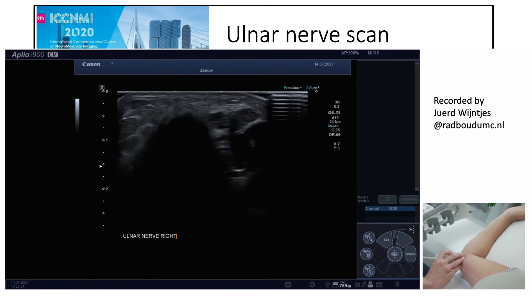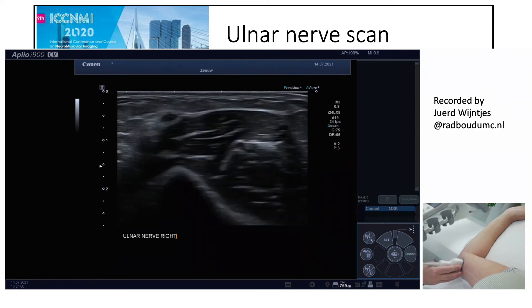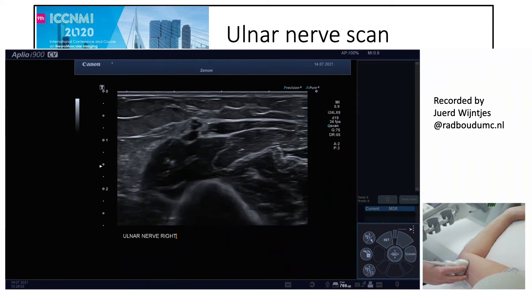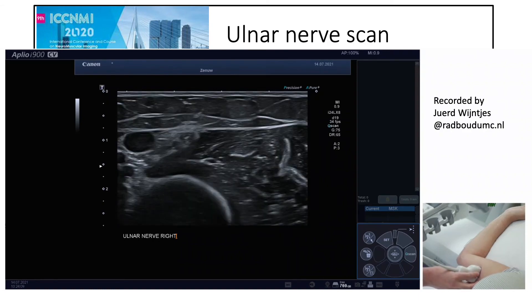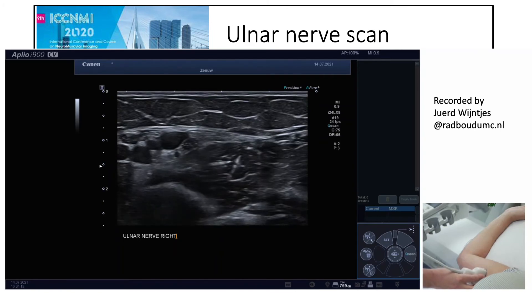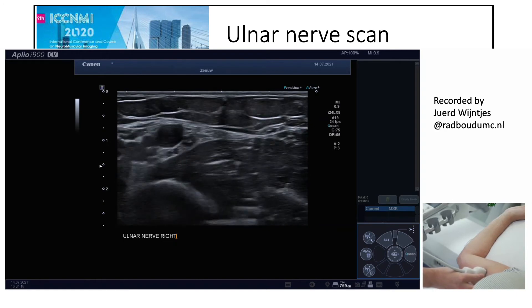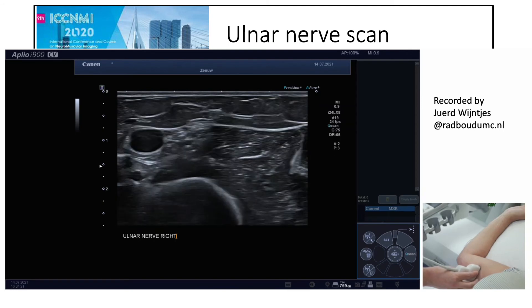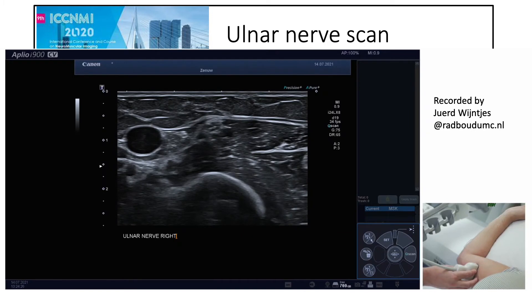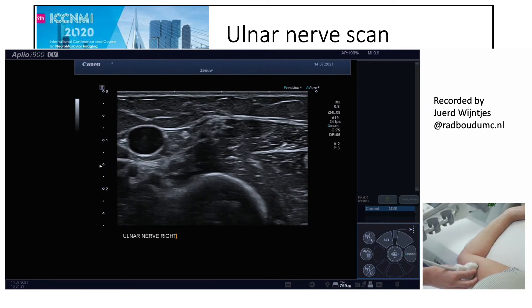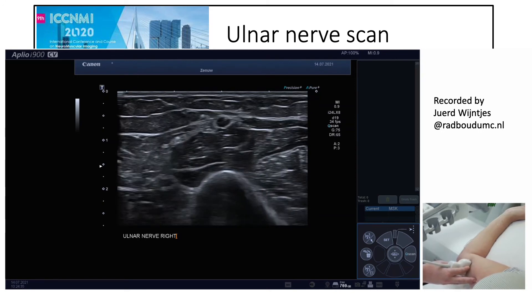In the scan demo, the medial epicondyle is identified here, and this is the ulnar nerve. We then move proximally — you can see the ulnar nerve here on the right, then in the middle — and it comes near the veins and the brachial artery. We then go down again, with the ulnar nerve visible in the middle, and stop at various points to measure the cross-sectional area at different levels.